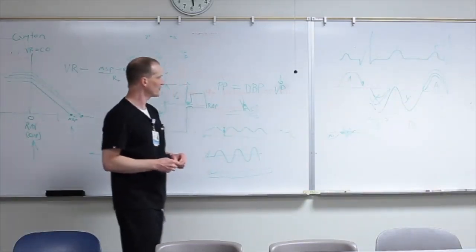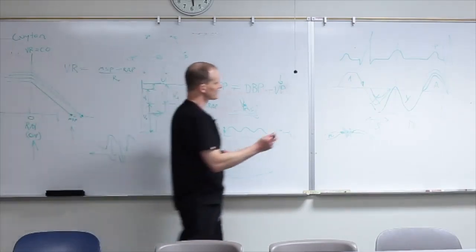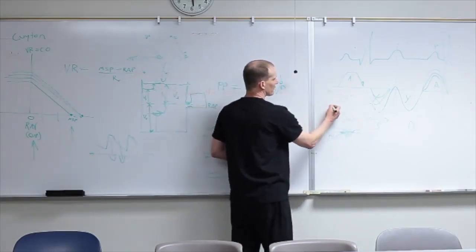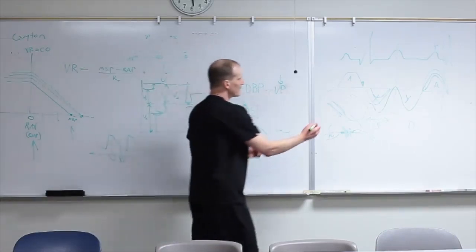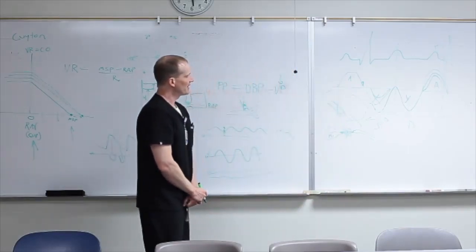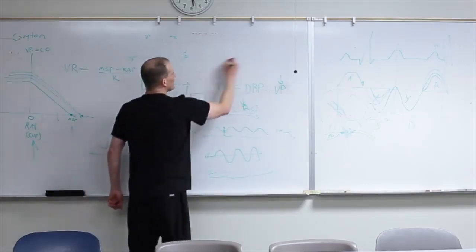Usually, as far as the portal vein goes, you all know the IVC. We're going to start here, trying to find a portal vein, moving the probe. A lot of times over here is where it's at, and you'll see the portal veins come in, usually a vessel like this, and it'll be a bigger one. If you drop the pulse wave Doppler in the middle of that, then you'll hopefully get this. So you don't want to confuse it with the hepatic vein. And what's the hepatic vein going to look like? Again, it's going to look like this.